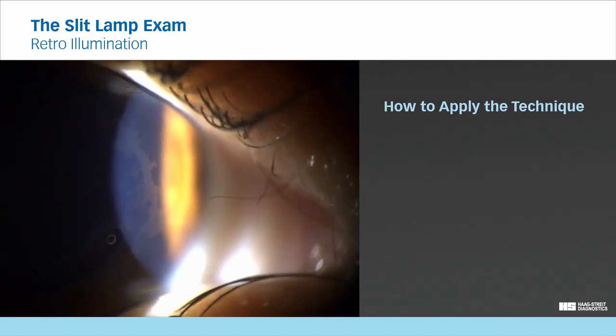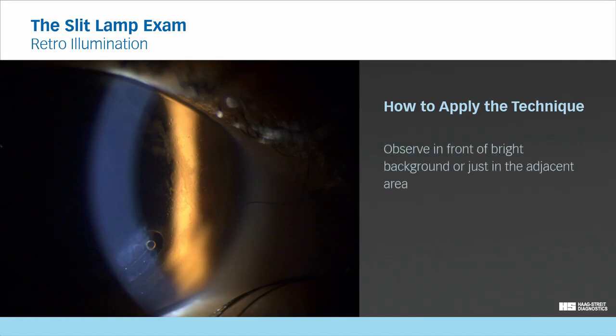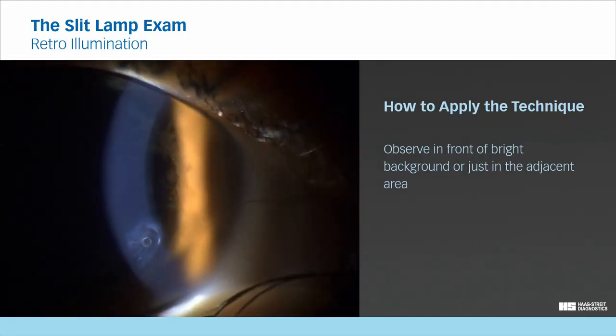To use retroillumination, focus on the area of interest and illuminate the structure behind it. With direct retroillumination, you observe directly in front of the illuminated background. With indirect retroillumination, you look just adjacent to the reflecting area. Depending on the properties of the irregularity, visibility may be enhanced by either using direct or indirect retroillumination.